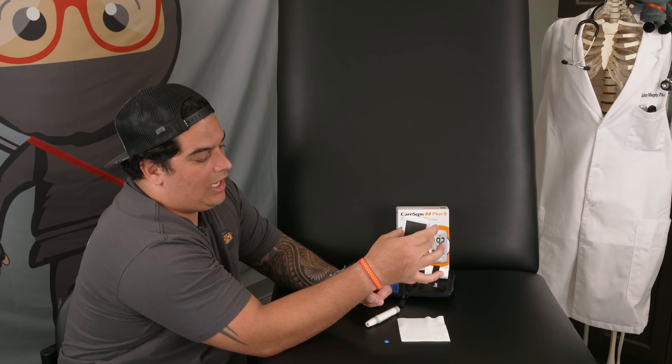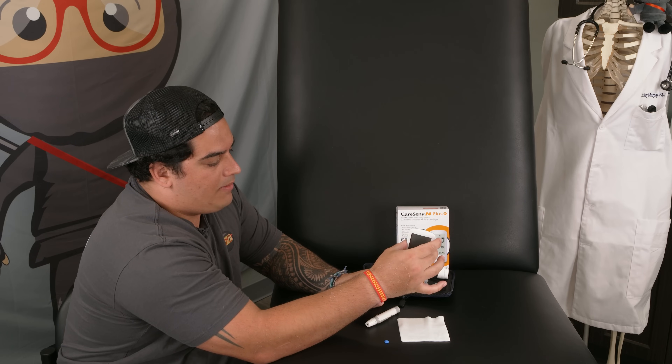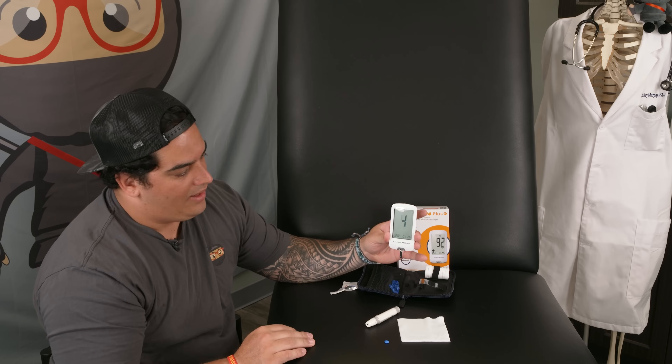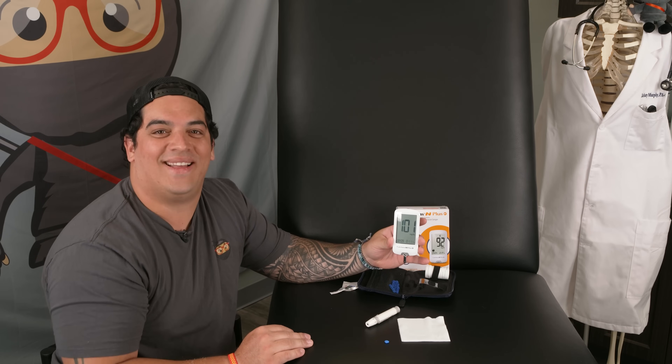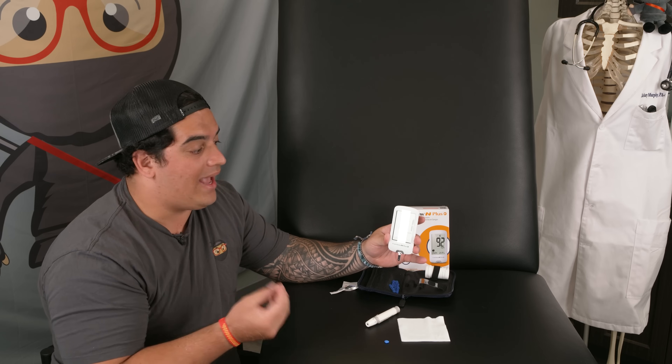I got a little droplet of blood there. I'm going to take the glucometer device, hold it upright, and bring the test strip near the droplet so it sucks up a little bit of blood. After a couple of seconds it gives me my number. 101 — that's not too bad! That's how you record your actual glucose level.